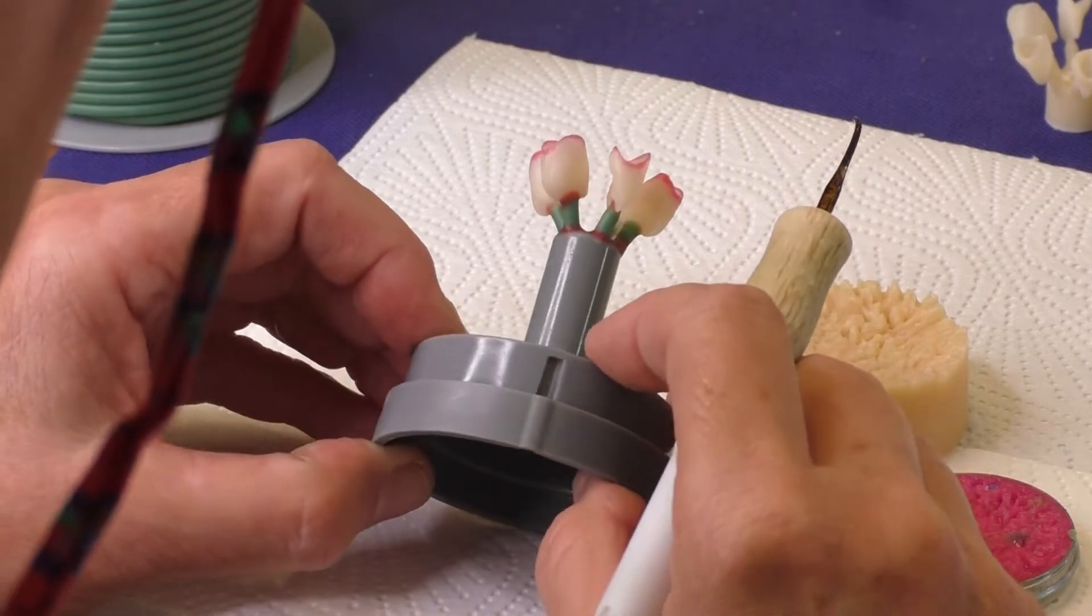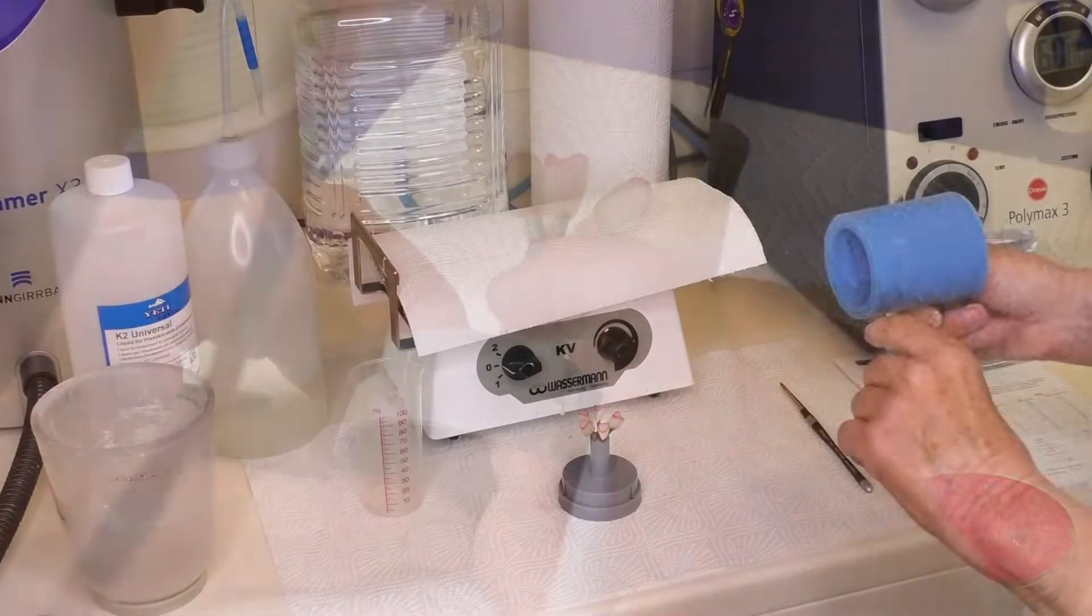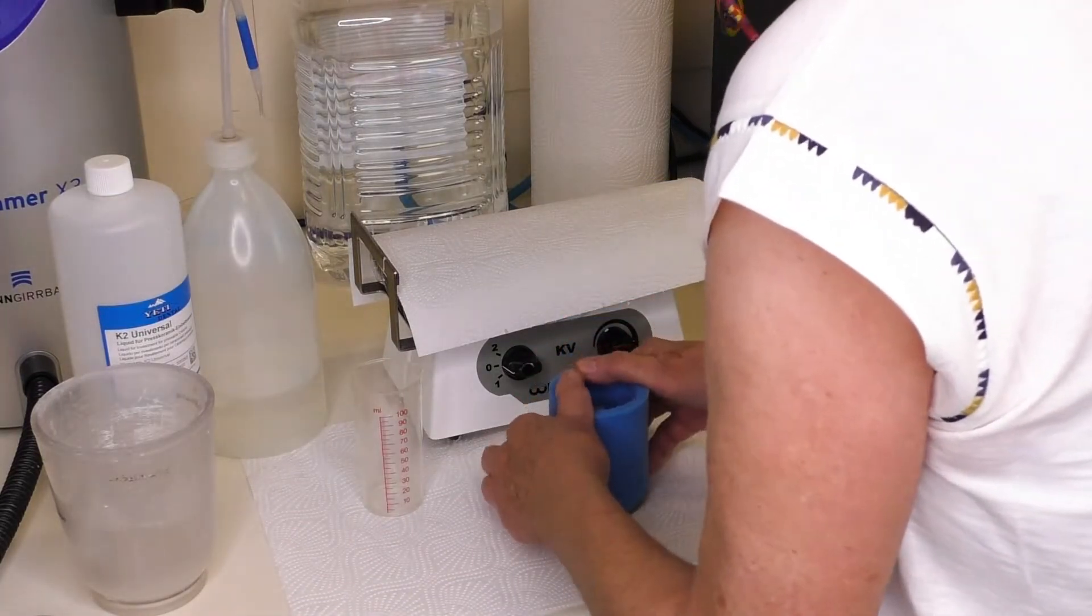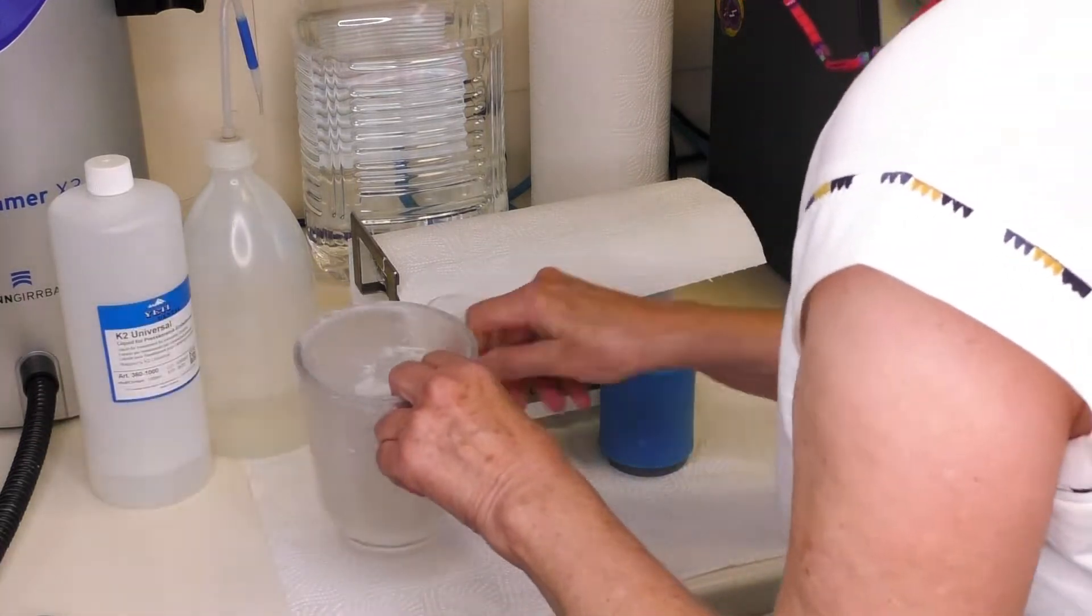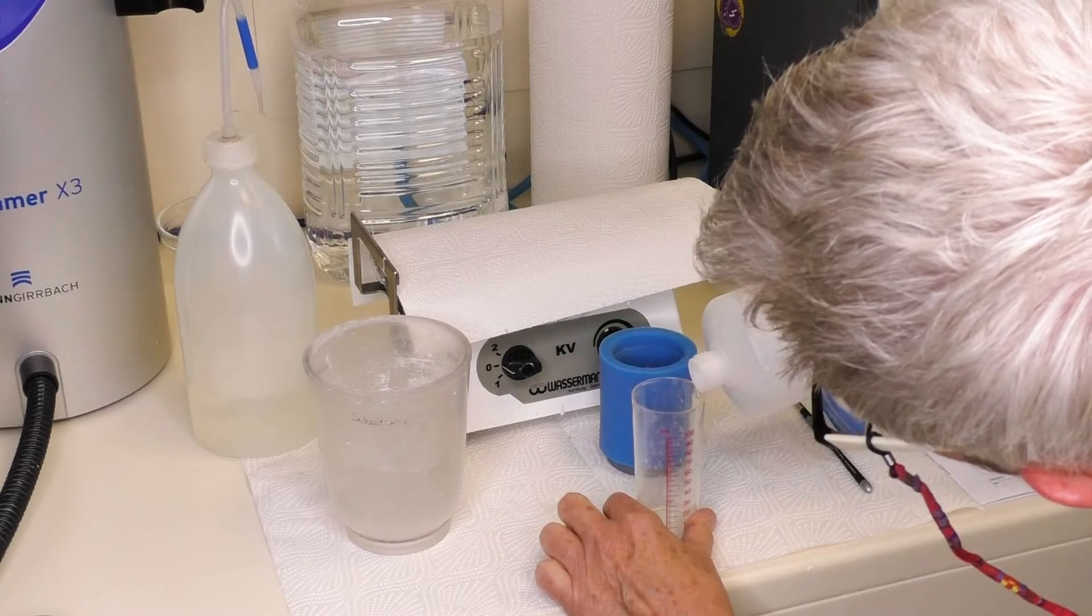The angle when fixing the object on the base should be 45 degrees. Fix the sprue in axial pressing direction. The pressed framework should never be thinner than the layer thickness of the veneering ceramic. It ensures the stability of the construction.